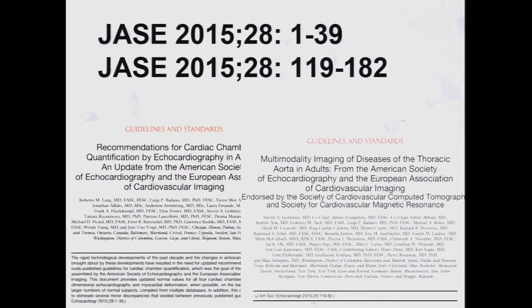These are the two guidelines that I refer to, published in January and February of this year in JASE, for aortic imaging and chamber quantification.